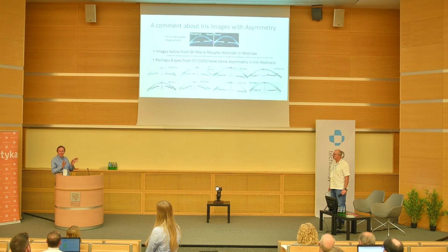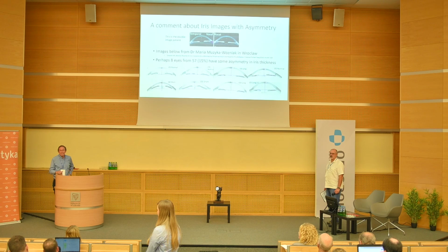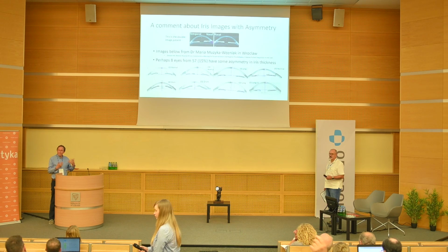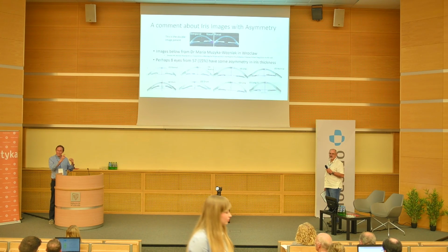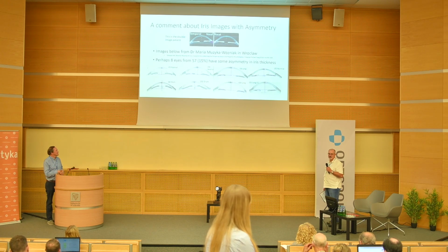Maria had a pre-existing paper that had long, medium, and short eyes, axial lengths. And then she divided into images. I was just trying to keep track of what I was looking at. It's because the anterior chamber is very... Yeah, you can see that something is short. That's a very short ACD, isn't it? So, which might be a related thing. It could be that if you've got a very short ACD, maybe you need this blocking or transmission or something. I don't know.